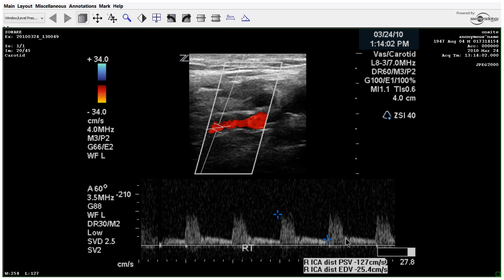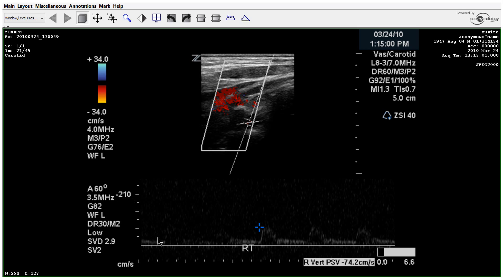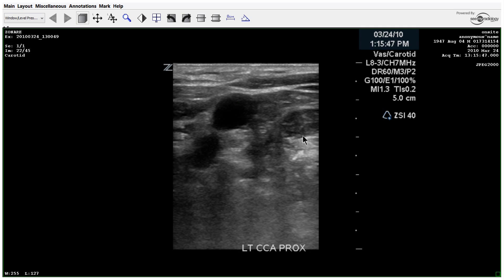Moving distally, you can see the disturbed flow and we've got 127. The vertebrals appear antegrade. You can tell the red is moving away from the probe — we have our negative sign and the negative is on top of the baseline, confirming this is antegrade. Now moving over to the left side.